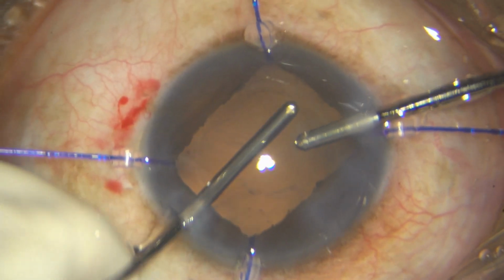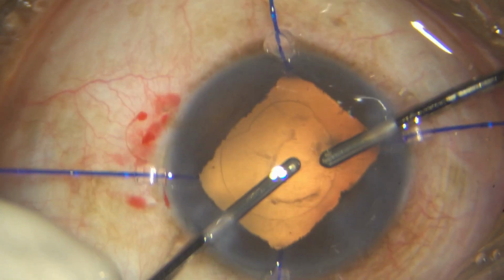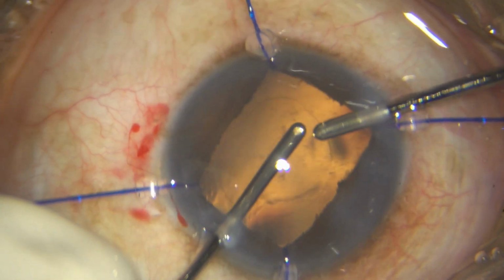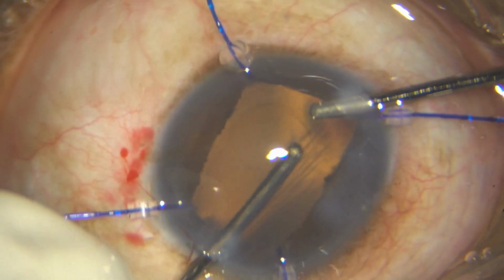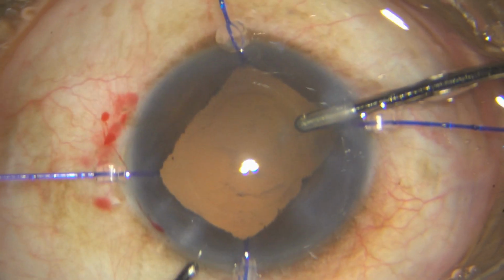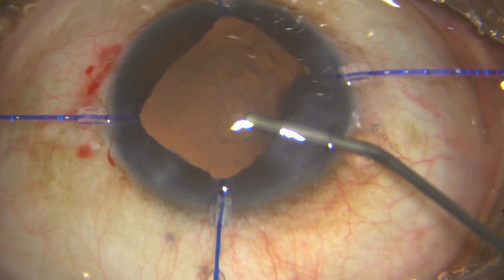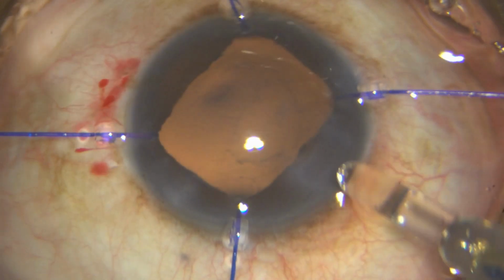I'm not going to attempt to take it out. I don't want to polish this because I am pretty sure any attempt at polishing will definitely rupture the capsule. I do try to push it with my visco cannula, not helping. Capsule is too loose, so I just put in my visco. The central area is pretty clear, I don't have to worry.